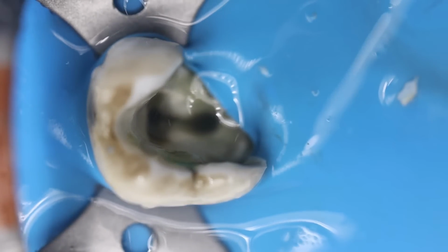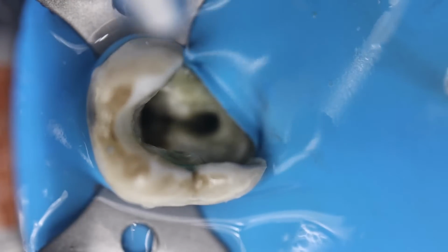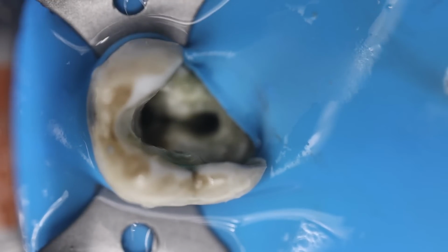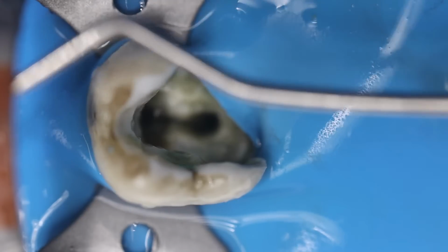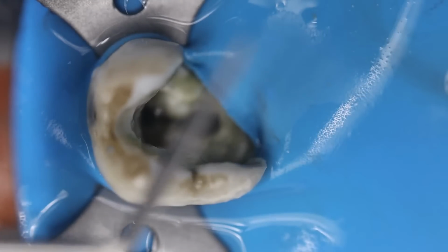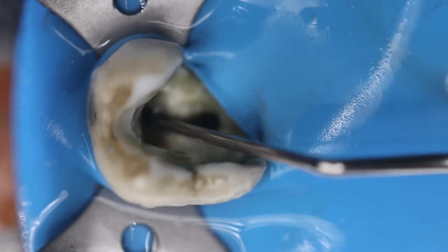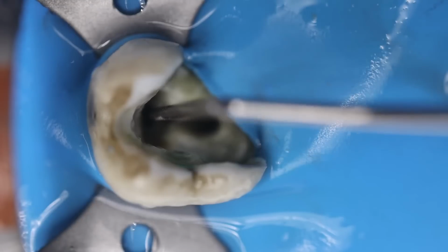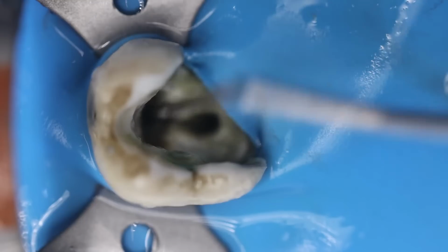See now, you can easily visualize the access that we have obtained. Now what you can do is use your DG16 probe. This probe has a fine tip at both ends. Just engage it into the orifices, and you will see that this probe gets engaged into the orifice and hangs over there.